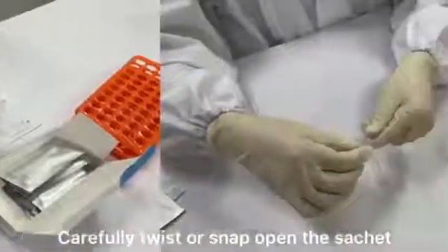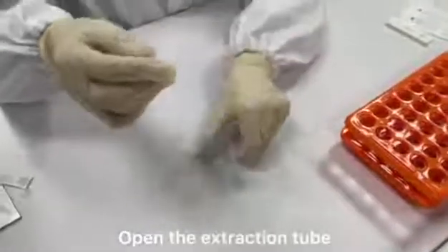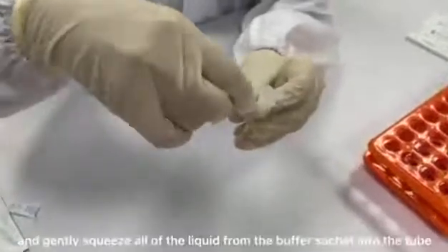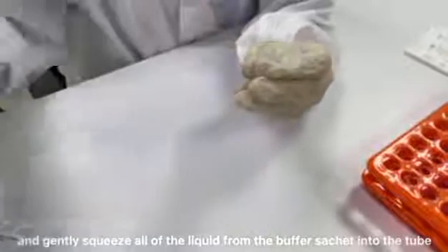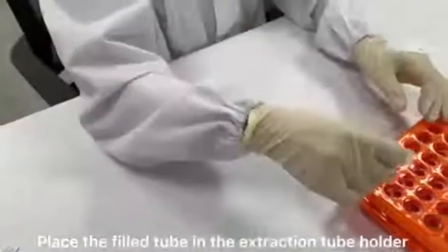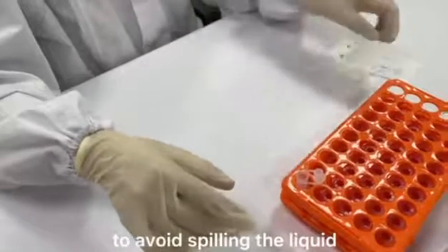Carefully twist or snap open the sachet. Open the extraction tube and gently squeeze all of the liquid from the buffer sachet into the tube. Place the tube in the extraction tube holder to avoid spilling the liquid.